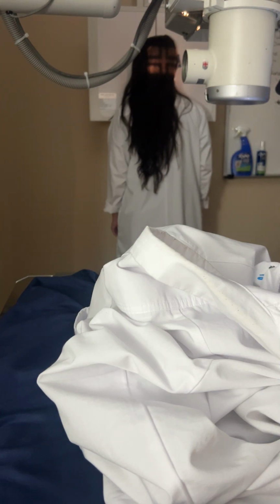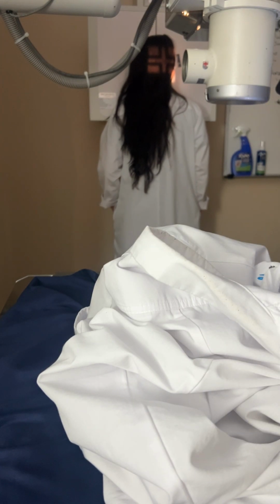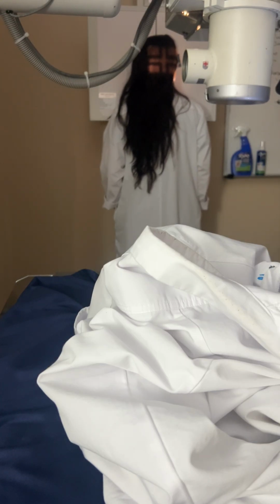So the orbit that's in contact with the Bucky is the downside. Cheek, chin, nose, okay? Because basically what we're doing is getting those three placed on the IR so that we can see straight through that eye socket, okay? And evaluate what's called the optic foramen, okay? Make sense? Yeah.